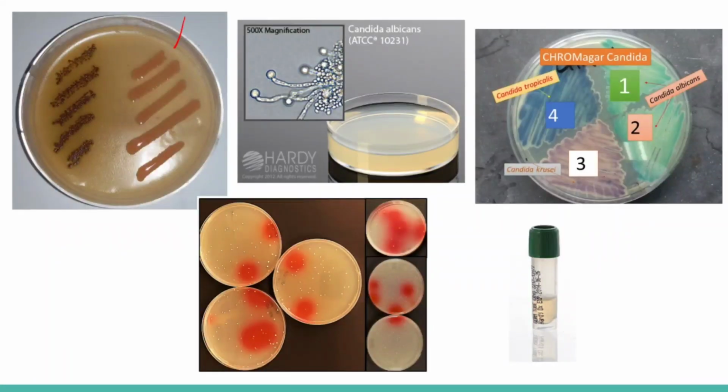Okay, so this is the bird seed agar or the Niger seed agar. So, this is for your Cryptococcus neoformans. Next one, we have the cornmeal with Tween 80 agar. Okay, kanina yan? Candida species. Next one, we have the chrome agar Candida. So, ayan, mapapansin nyo, there are different pigmentation sa mga different Candida species. So, pag albicans, apple green siya, no?